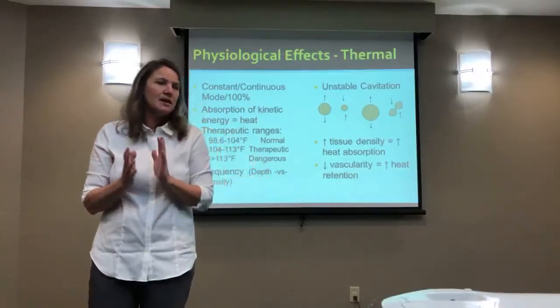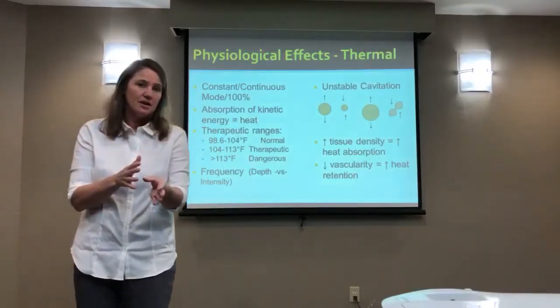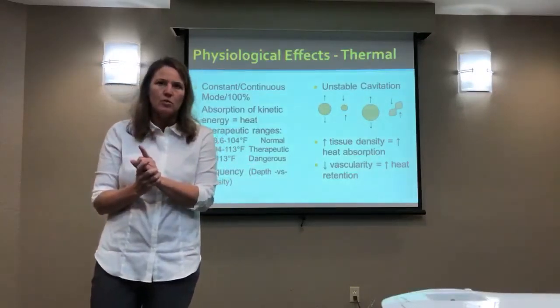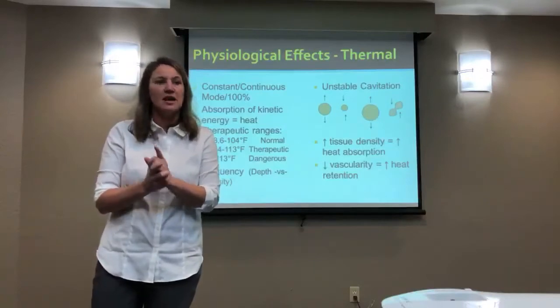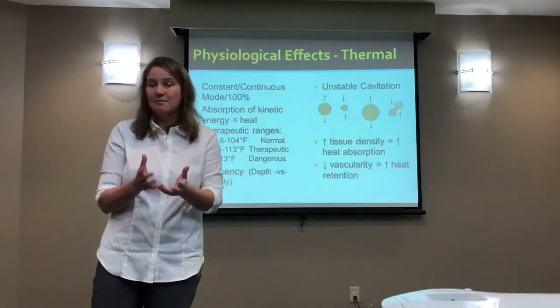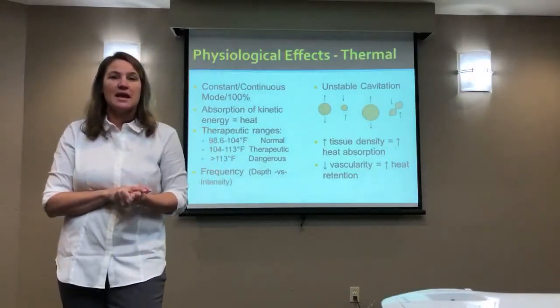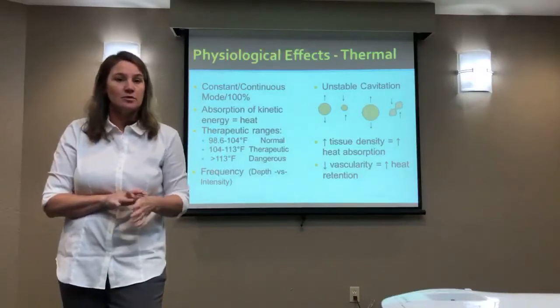So when I do a treatment, if my purpose is to increase range of motion and stretch something, I'm going to think about when is it going to be the hottest? When am I most likely going to be in that window? Well, while I'm doing it, right? The most likely time, the warmest time, the hottest time that tissue is going to be at that peak is going to be while I'm doing the treatment.